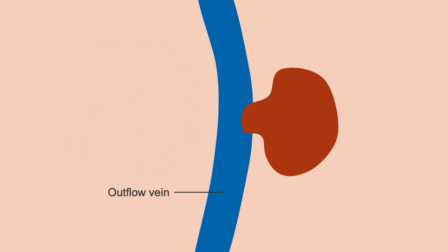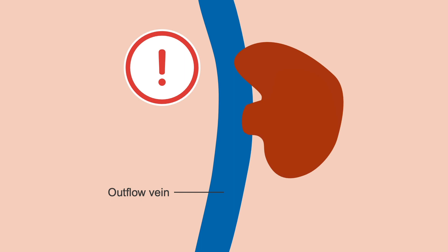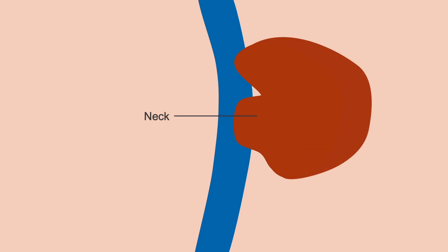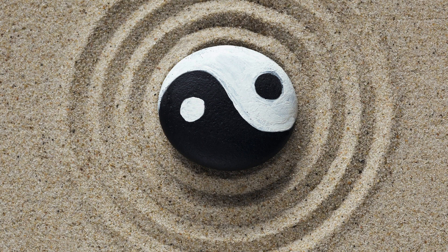Pseudoaneurysms are dangerous when they grow large enough to compress the fistula, as this can lead to stenosis and occlusion. Another danger is when the neck of the pseudoaneurysm — the connection to the outflow vein — widens to help the pseudoaneurysm expand, as this can cause increased compression of the outflow vessel. On color ultrasound, pseudoaneurysms have a classic yin-yang sign, due to the swirling blood flow within the collection.